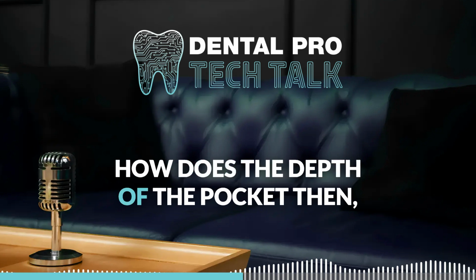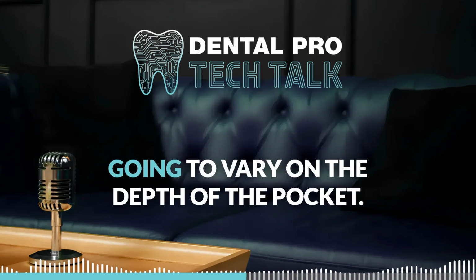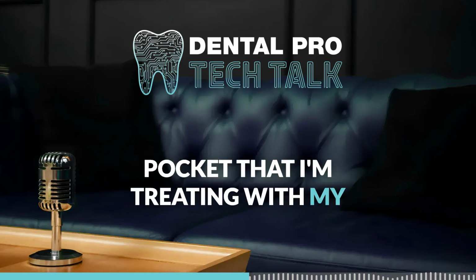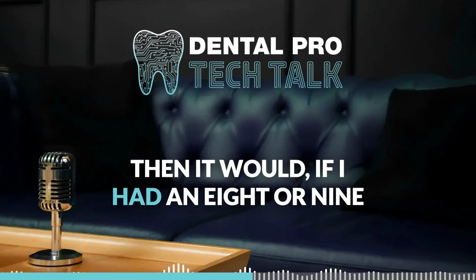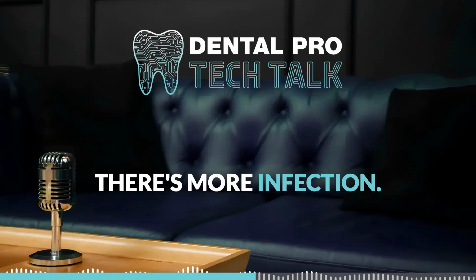How does the depth of the pocket then affect our technique? We don't have to say we can only stay in for a certain amount of time, because that's all going to vary on the depth of the pocket. So for instance, if I have a 4 millimeter pocket that I'm treating with my laser, that's going to take me a lot less time to cross-hatch in that diseased pocket than it would if I had an 8 or 9 millimeter pocket, because I'm going to need to spend more time in the pocket because there's more infection.